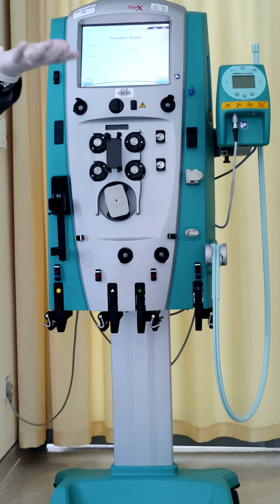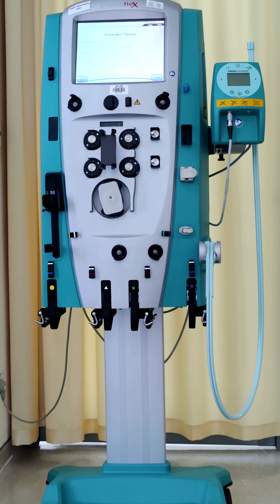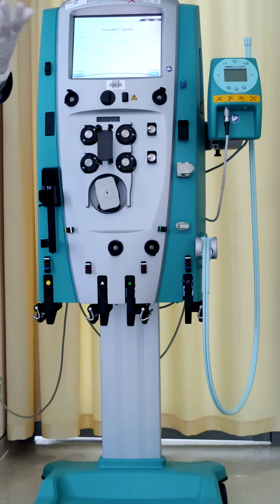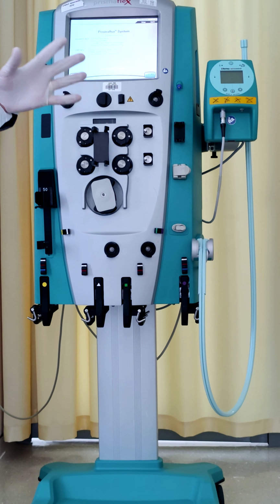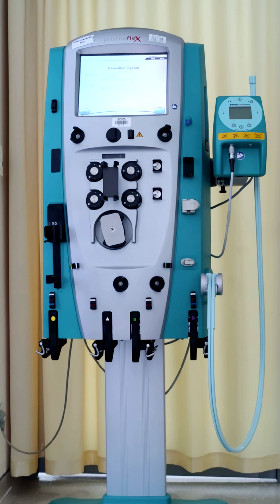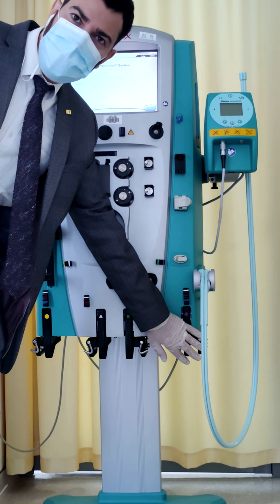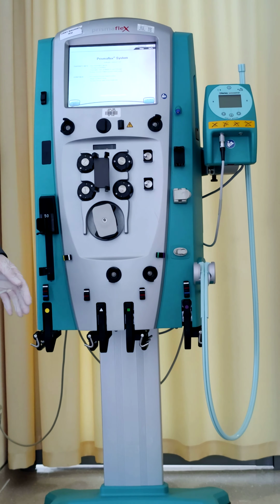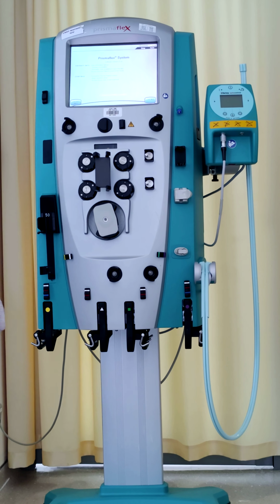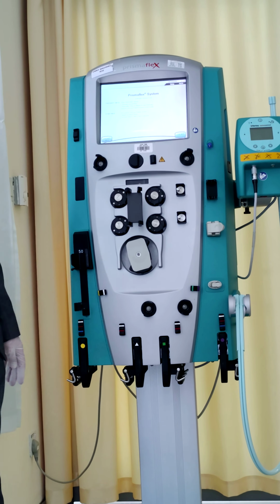For the setting, like what we mentioned now, we have to know the patient body weight and patient hematocrit, to be able to write the right prescription and calculate it. There is a very important point, maybe this is the seventh point, about the replacement bag. In the replacement bag, usually we are using small bags for frozen plasma or for albumin or a mix like this.